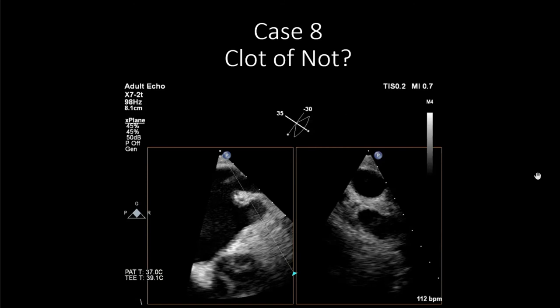It depends on your 2D imaging and your comfort level looking at 3D. Using biplane and the biplane mode of 3D is probably more useful than anything else. The surgeon and the interventionist have never thanked you for saying 'I think maybe' or 'I'm 90% certain' — they want a 100% guarantee, yes or no. So we try to give a definitive answer or say you need to confirm with a CT. In that last case, we said it's very unusual — we see something, but it would be weird for someone fully anticoagulated to still have something there. So we said, do a CT with contrast — five minutes, you get an answer, they can still get their procedure.